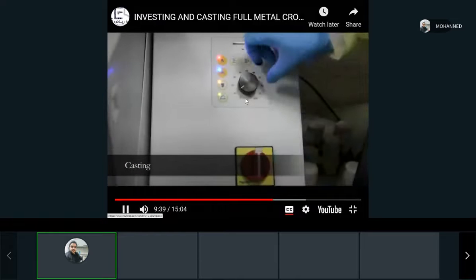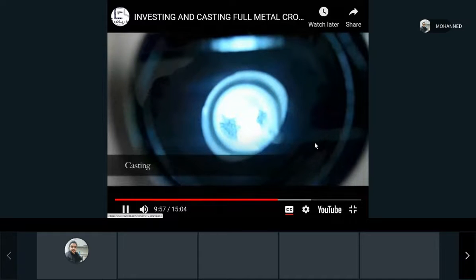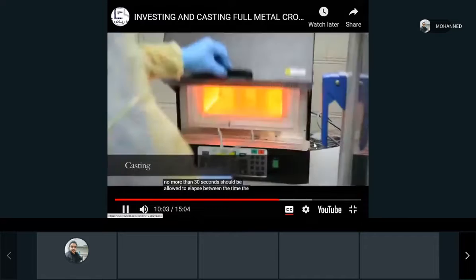It will start heating up where it's starting to melt. You see, this is the metal. It's going to start to melt in a little bit. There you go. No more than 30 seconds should be allowed to elapse between the time the ring is removed from the oven.